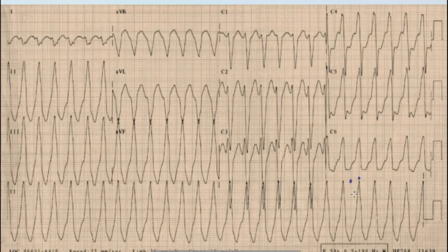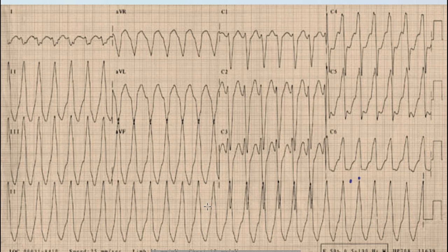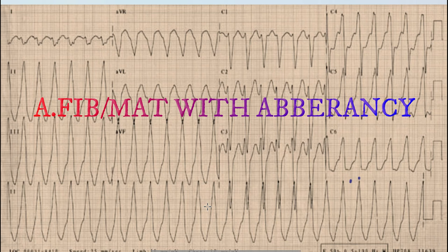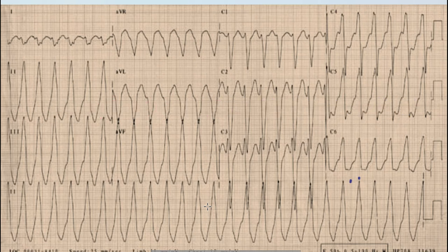In the case of a broad complex tachycardia, the next question you should ask is whether this is a regular or irregular broad complex tachycardia. If the broad complex tachycardia is irregular, it would mean atrial fibrillation or multifocal atrial tachycardia with aberrancy.